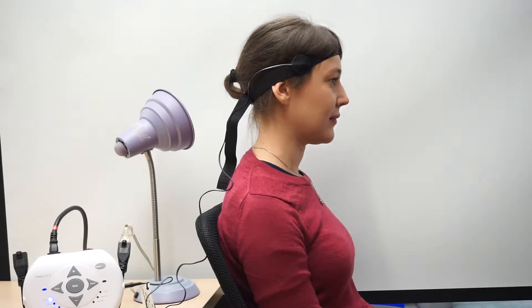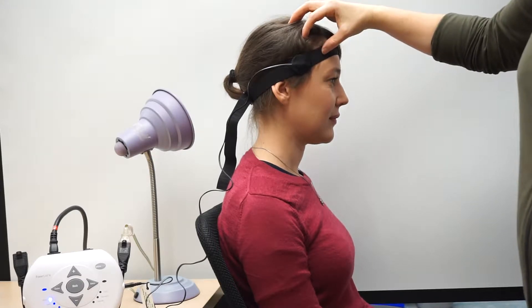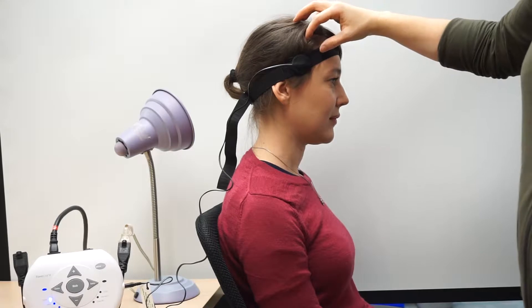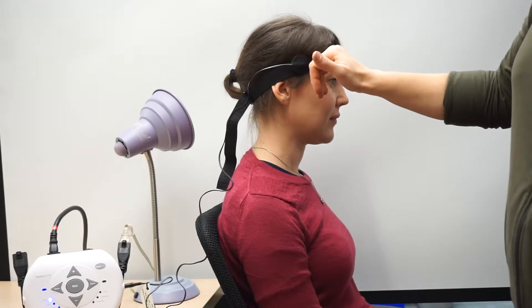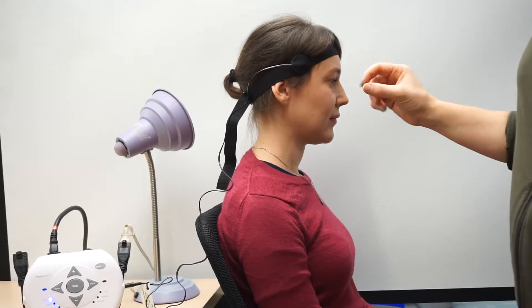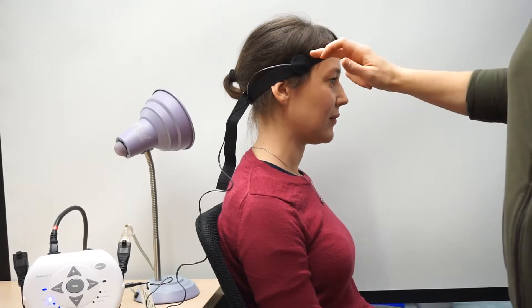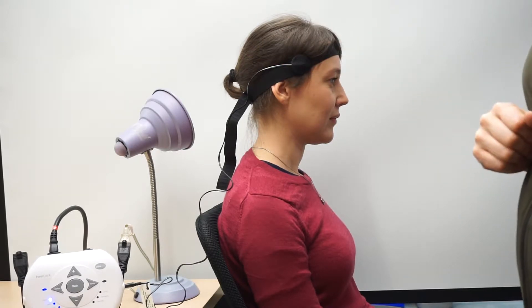The switch is mounted on a band which can go around the user's head, arm, leg, or anywhere that you're going to mount it. There's a small piece of Velcro on the headband as well as on the Tilt Switch, which is just this round piece there. You'll notice that a wire is coming out of the back of the Tilt Switch.